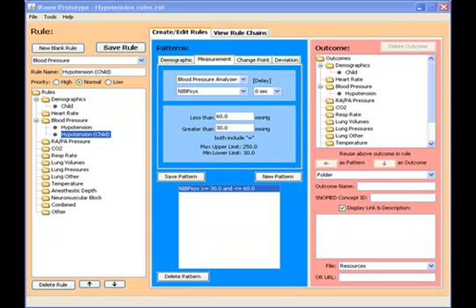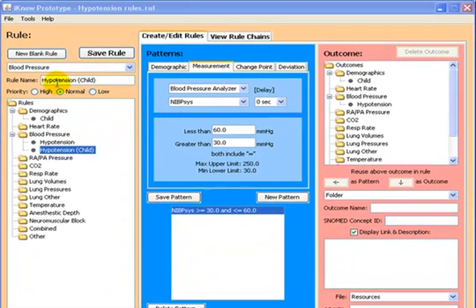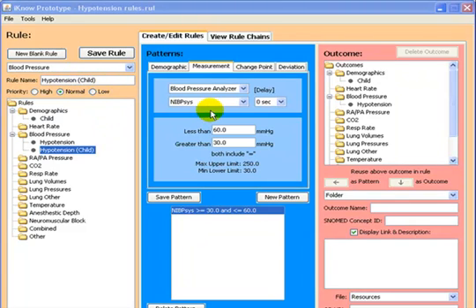I now wish to demonstrate how rule chaining works. In this example, we combine the rules of child with that of hypotension. So initially we make a new rule called hypotension in a child. For this we choose a measurement pattern which is very similar to the previous measurement pattern for hypotension, except we use a lower value for the systolic blood pressure.